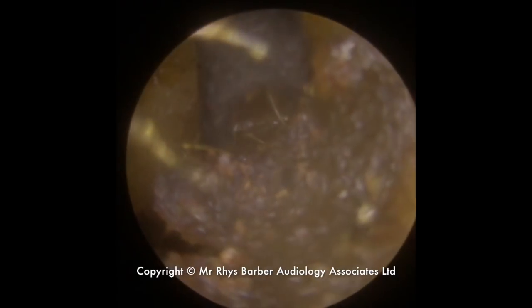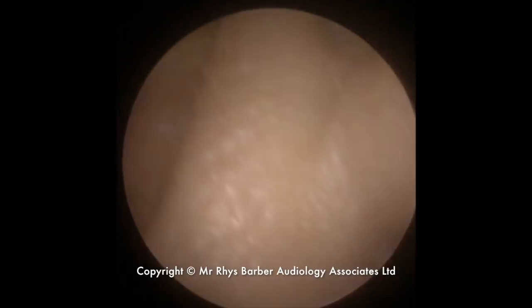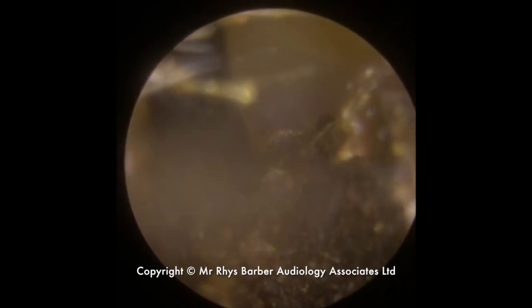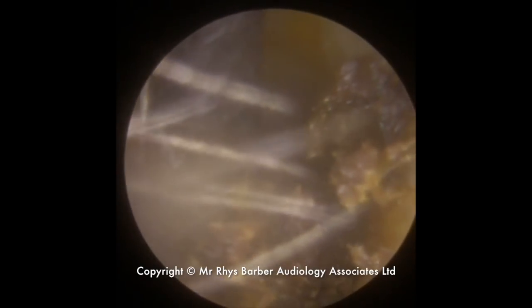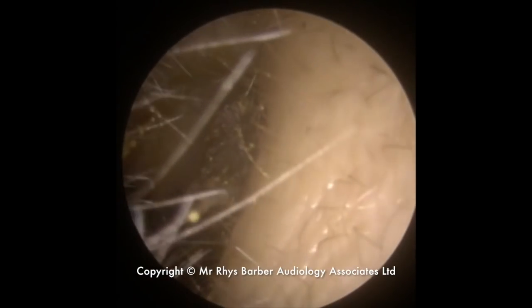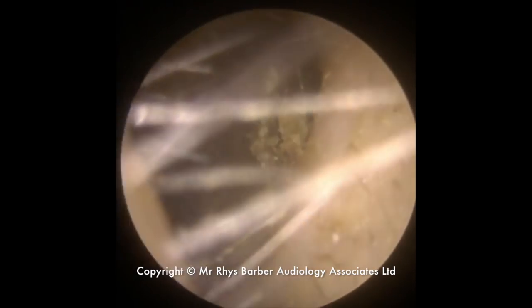When you use a Zollner tube, it just blocks the end of the Zollner very quickly. So what you have to do is keep clearing it out a lot, and you get a lot more out using the Jobson horn. What I like to do is try and take the central portion of wax away first of all — create a little valley in the middle, and then use the Zollner tube to pull the wax away from the canal walls.